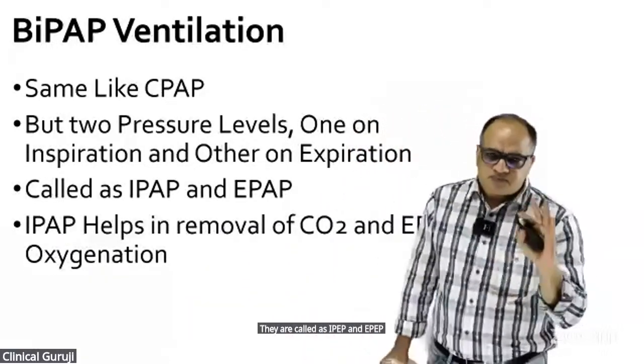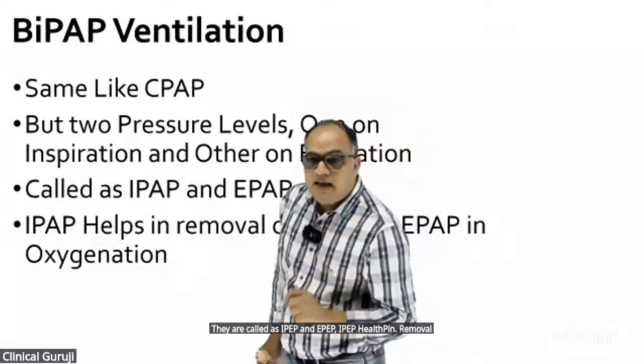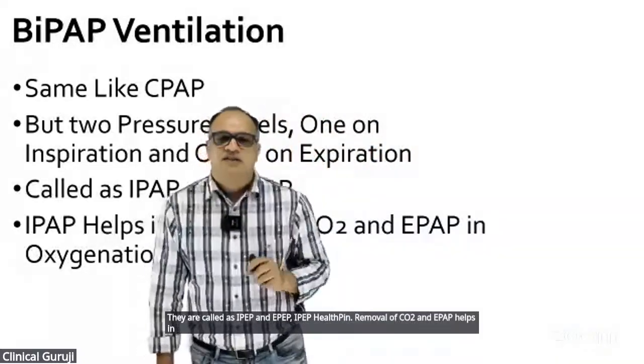IPAP helps in removal of CO2, and EPAP helps in oxygenation.